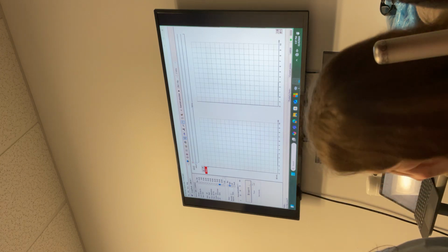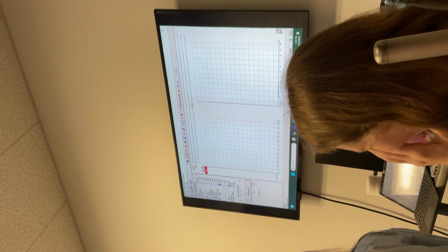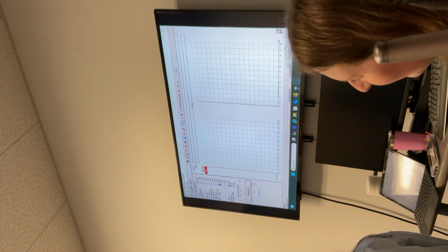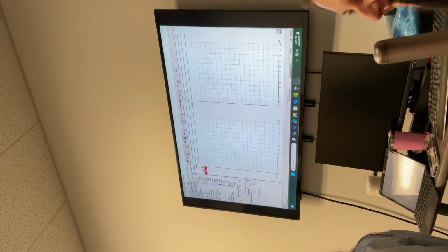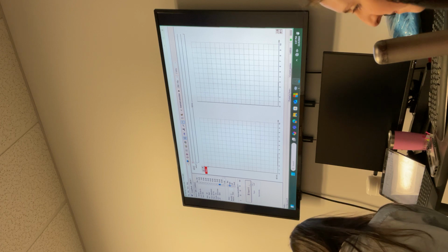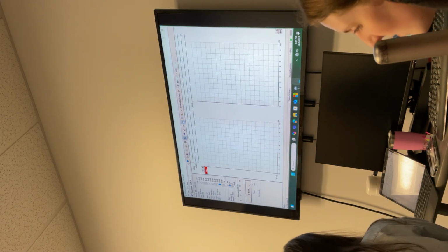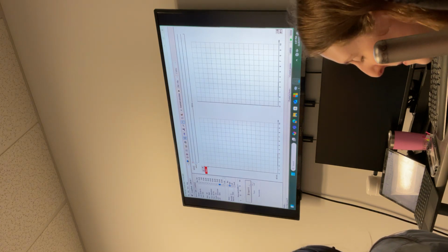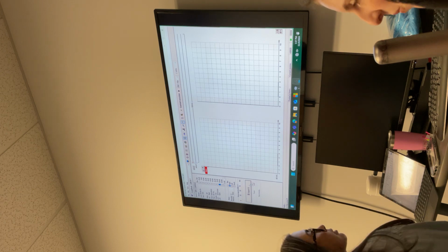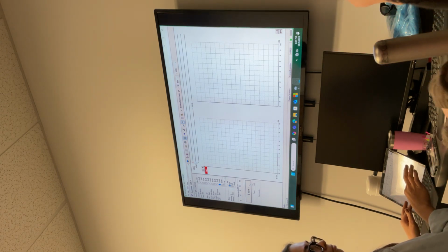Wait, we're doing click, not chirp? No, I'm doing loopback now, just to refresh all the stimuli. What's loopback? Loopback is the output from the transducer going through this loopback box, which is picked up by the electrode and going back to the system. This way we can visualize the stimulus, what we are playing. But is it part of the chirp testing? No, this is just for fun, just to be familiar with what the chirps are.